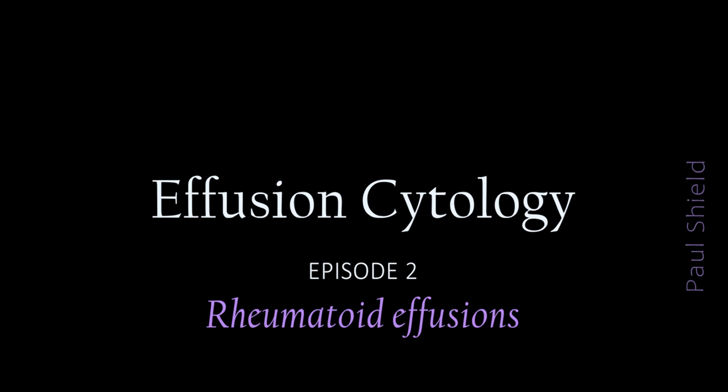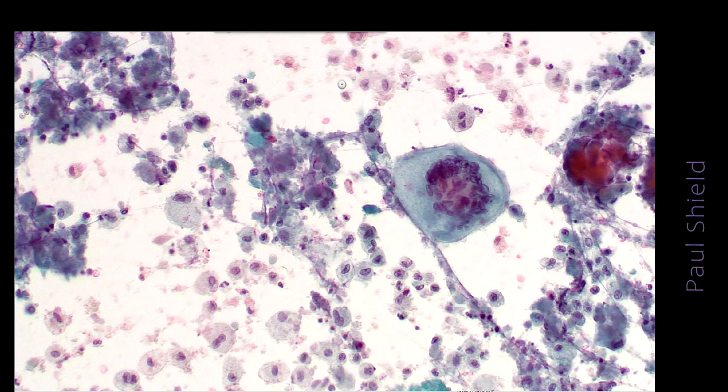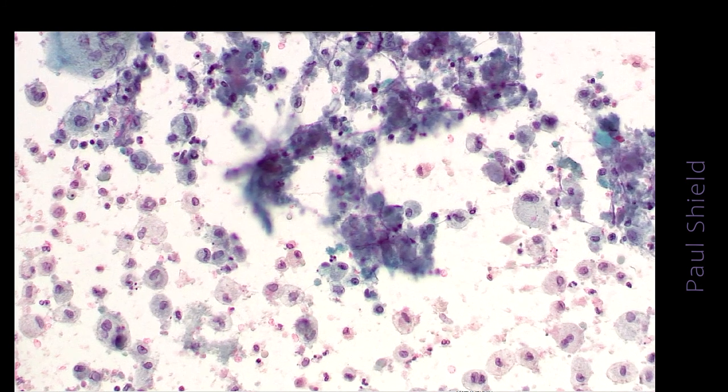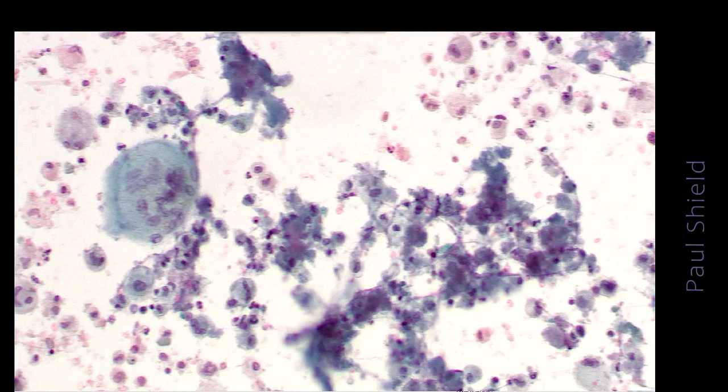only about 3 to 5% of patients. And essentially this presents as a granulomatous inflammation of the pleural cavity. What we see cytologically is very distinctive, a very dirty background to the slides that's made up of a lot of debris and foamy macrophages.